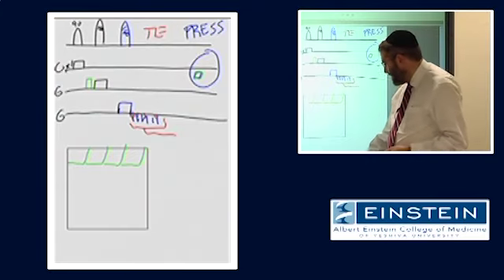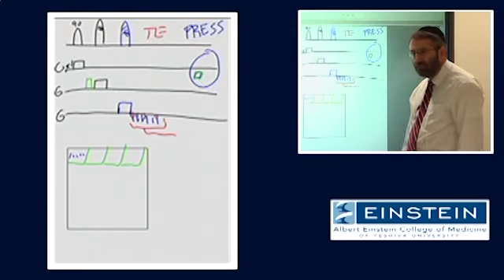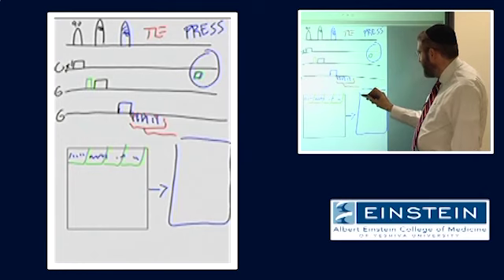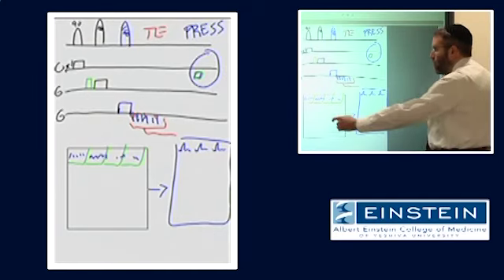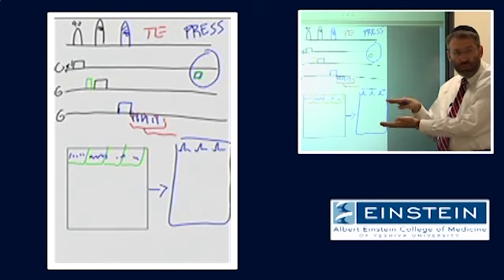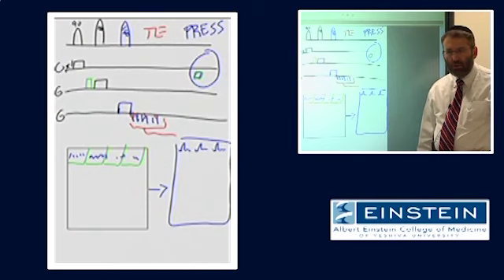What that means then is that I can independently Fourier transform each of these sets of samples, which means that that would give me a little proton spectrum for each and every one of these. And I can create that same single voxel spectrum from each and every one of these boxes. And they differ in what way? The amplitude of the signal in that spectrum gets less and less as this gradient that I applied gets more and more. Okay?